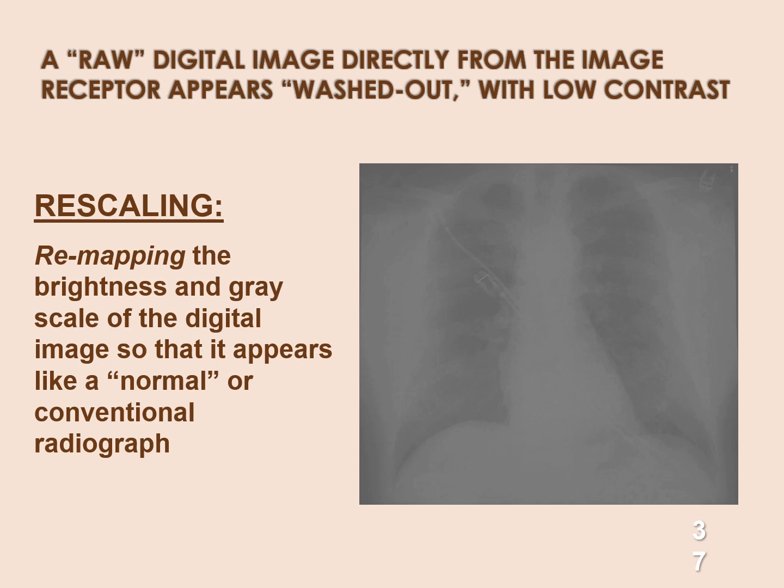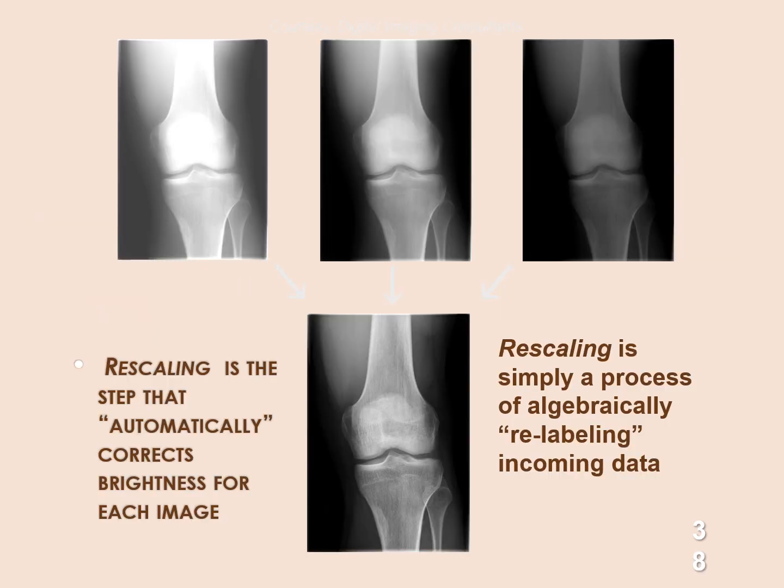You'll learn about that more in the spring. Okay? So when they rescale it, it relabels your incoming data. It basically fractions the intensity. So in screen film, those are the examples at the top: underexposed, optimal exposure, overexposed. No, all of those in the digital age look like the bottom one.